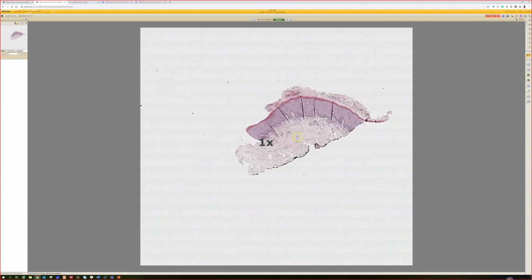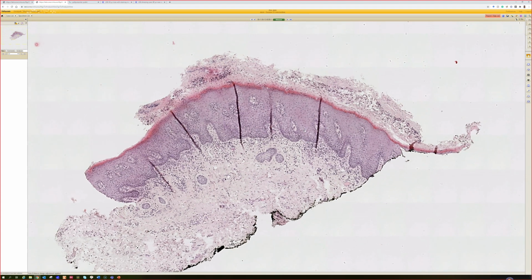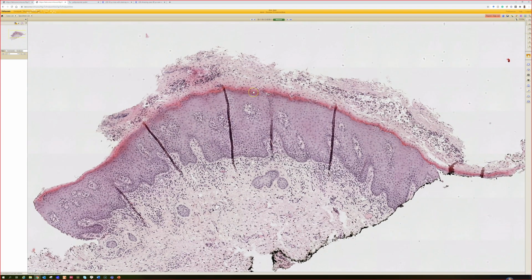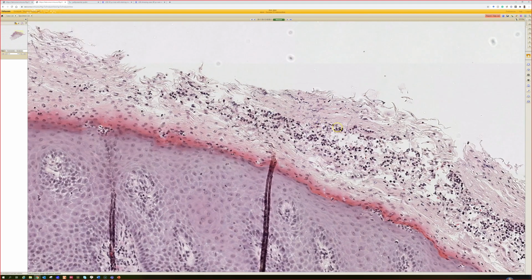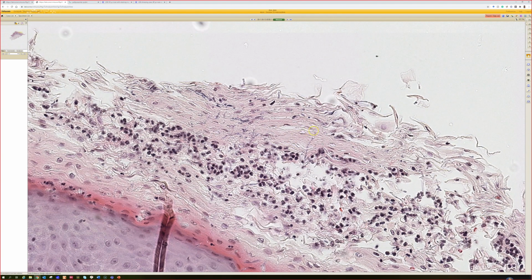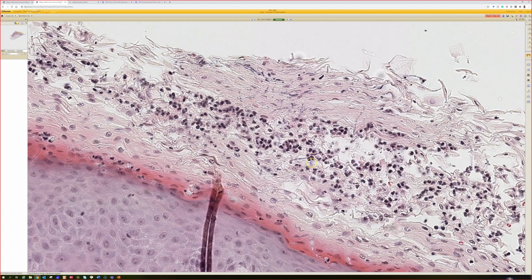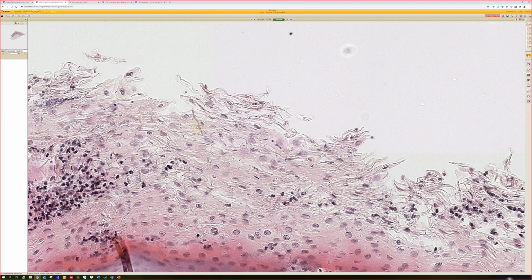Okay, excellent. Case 13. This one has a pale epidermis, so it makes me think of a mucosal surface. Good, mucosa, yes. So let's say vulva. Okay. And then this one has pseudohyphae in the stratum corneum, some of which are really hard to see, but they're running north to south. Yep, up and down, right? Kind of vertical. Good. Here's some right here. There's a hypha or pseudohypha.